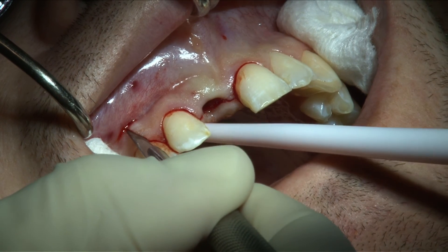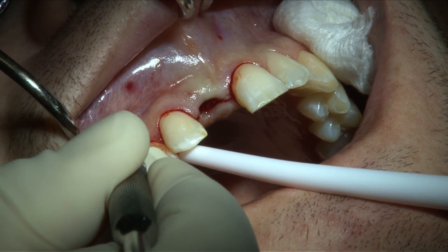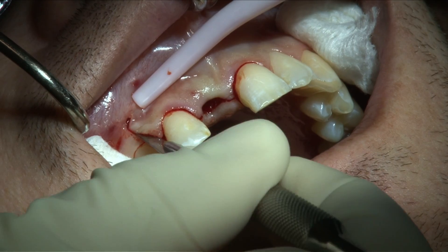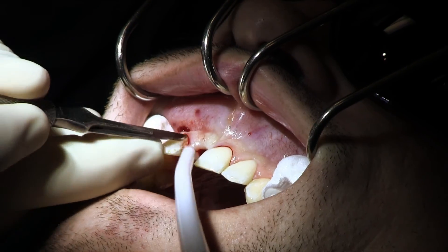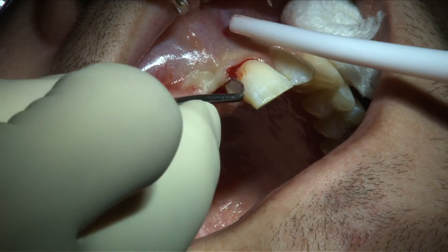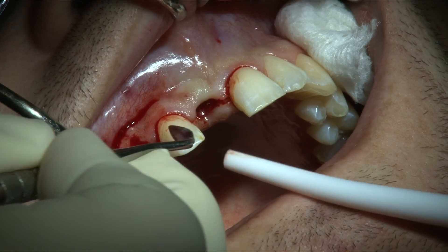The vertical incision is then extended apically beyond the mucogingival junction. The flap is freed from the margin of the alveolar bone and the necks of the teeth. A Goldman-Fox interdental knife is then used to reflect the flap. Care is taken to carefully elevate the flap without damaging the tissues.